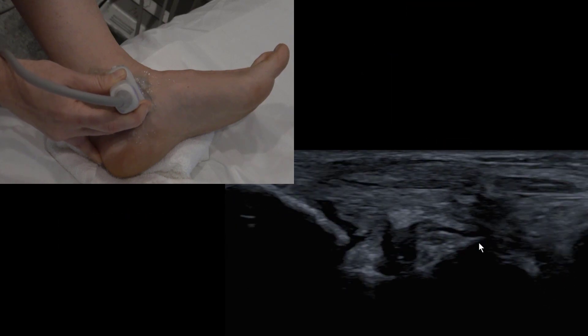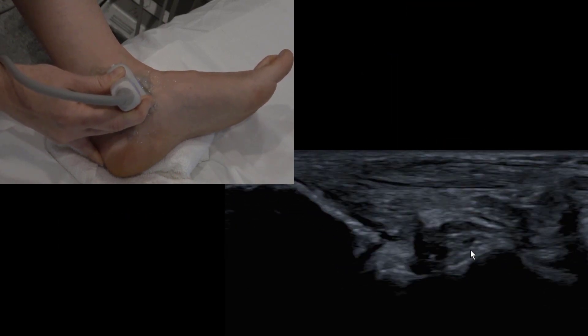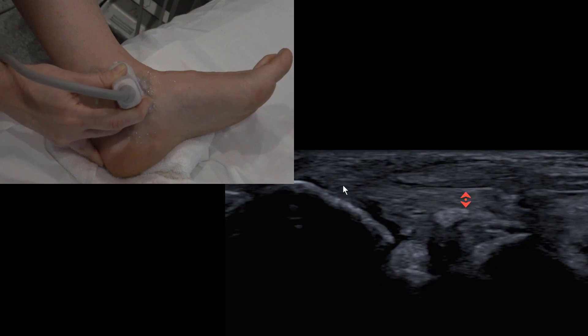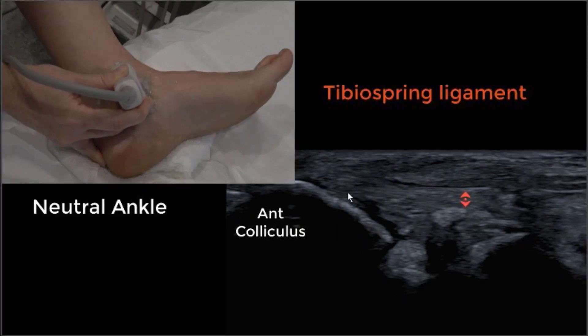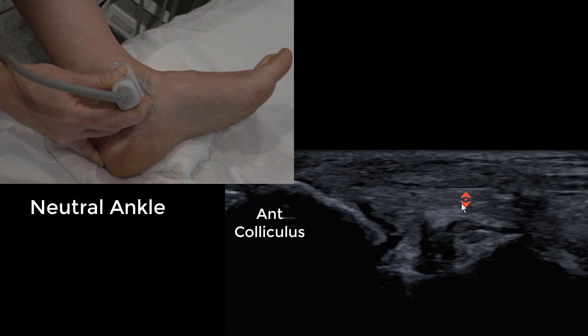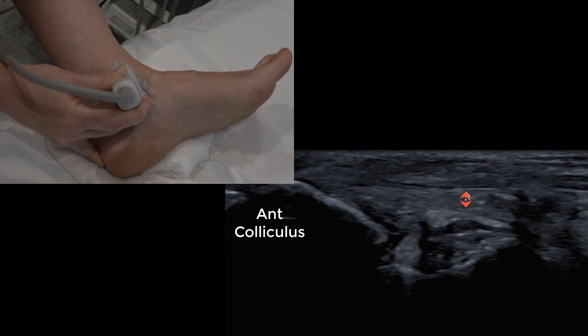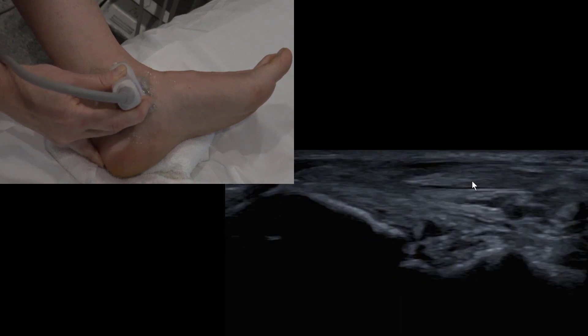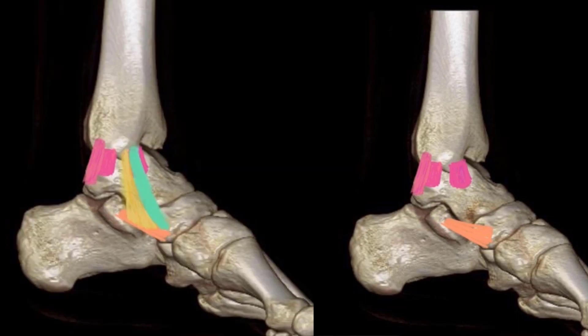If you rotate slightly more anteriorly, those ligament fibers are going to blend with the tibio spring ligament. The tibio spring ligament is a little thicker, it's always there, and it inserts into a ligament so you don't see a bone on the right hand side of the screen. We see tib post over the top, and you know you're on tibio spring because we're seeing the spring ligament to the right of the screen — that's the orange band running from sustentaculum tali to navicular.